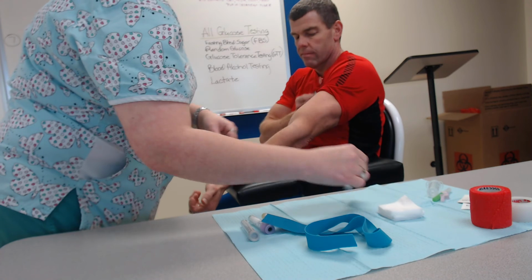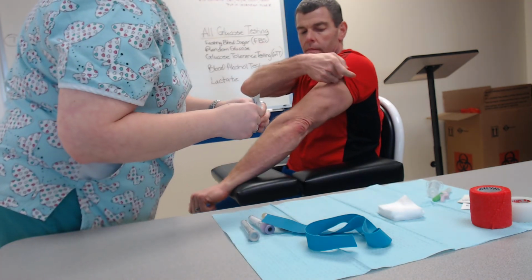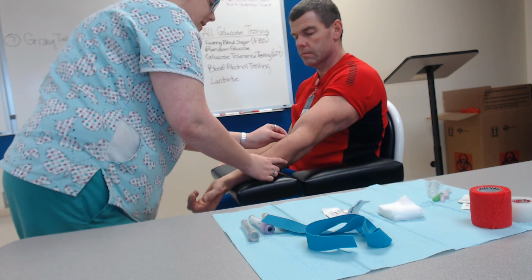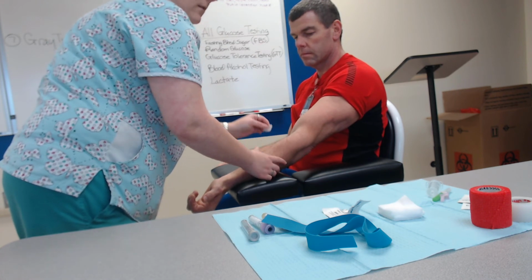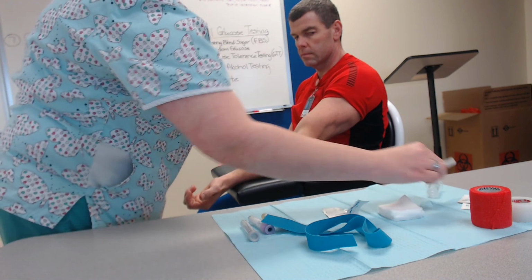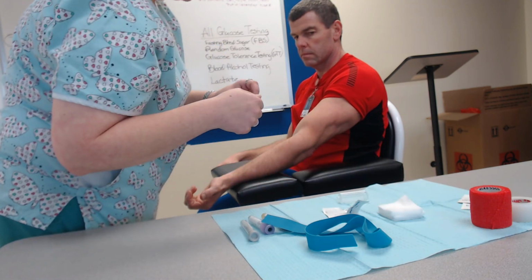And you then want to clean the area that you're going to be drawing blood with an alcohol prep pad. Okay. And while that's drying, you can go ahead and set up your needle.